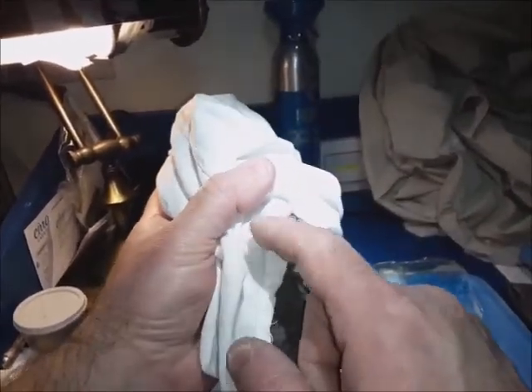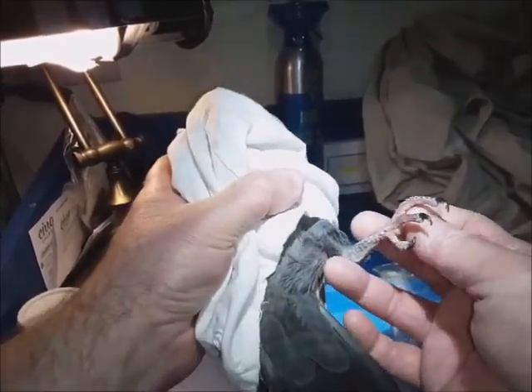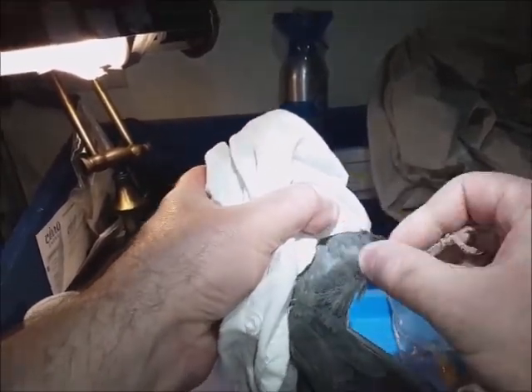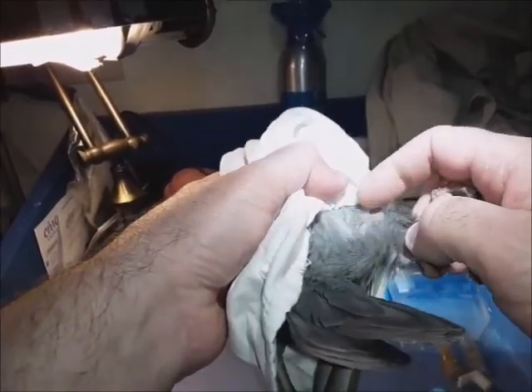Cover their other leg and keep the leg exposed that you're going to give the injection. It's easier to give the injection on the inside of the leg because the feathers are not as thick on the inside near the belly.